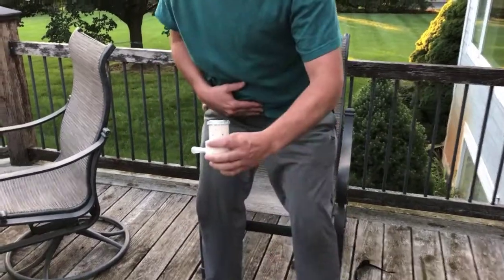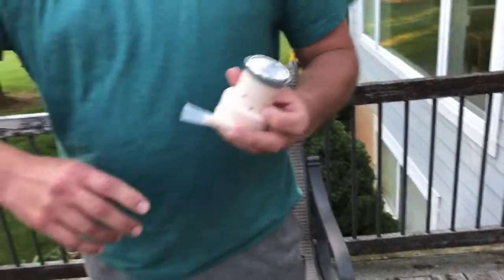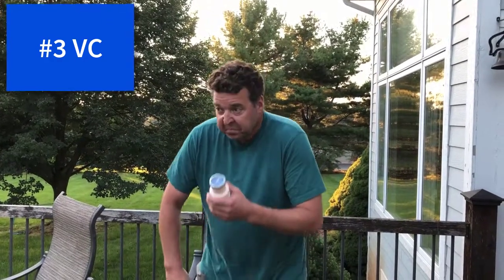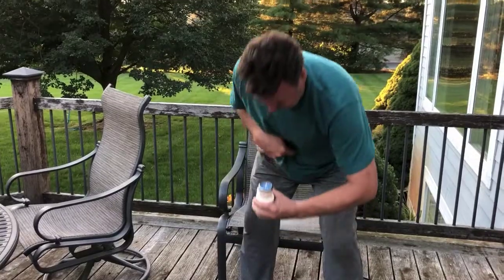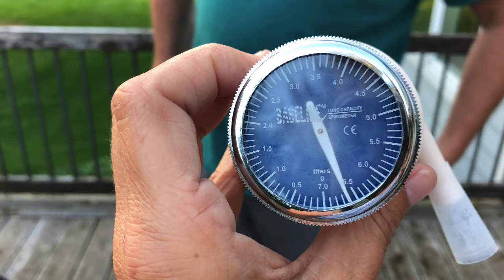Okay. Oh, so close. Oh my gosh. So I would say that's 6.8. Come on, liters. I can beat 7. Go ahead and reset it. Trial 3, vital capacity for Chris. Oh, couldn't beat the 7. All right, so trial 3 looks like 6.6 liters.